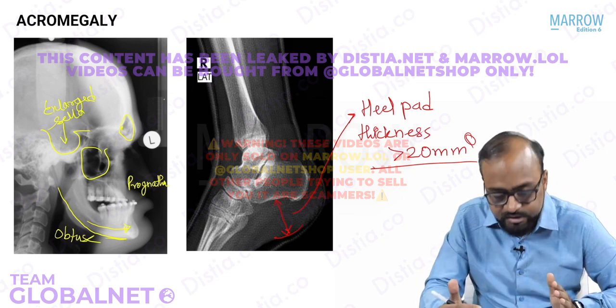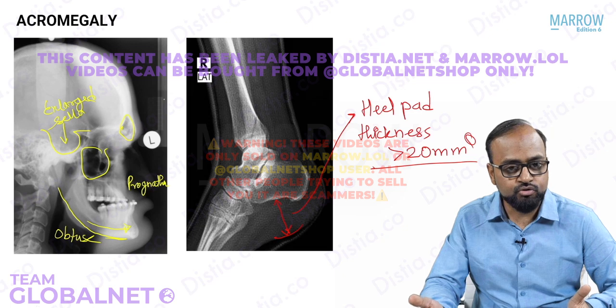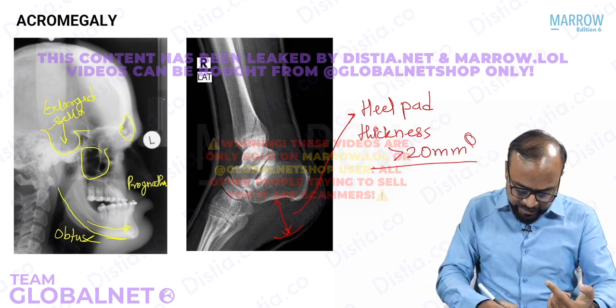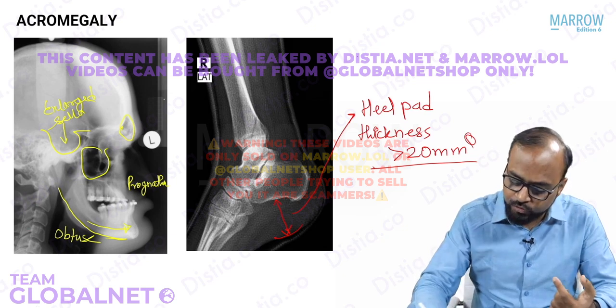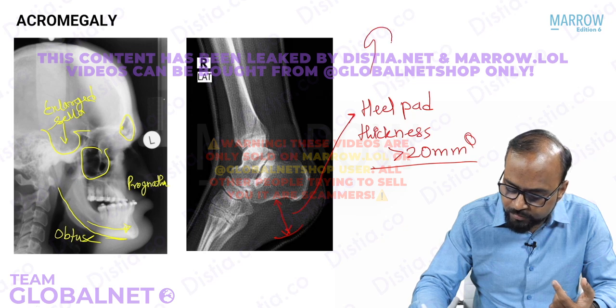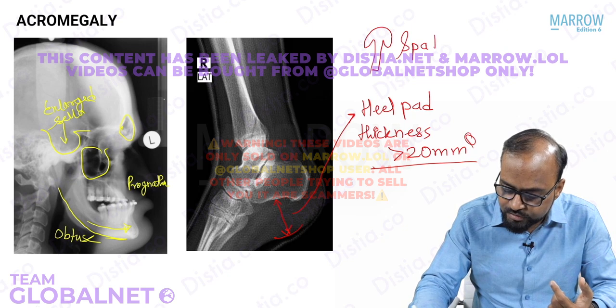Now heel pad thickness, increased soft tissue thickness is also there. Now the phalanx takes a very peculiar shape, though I could not find a specific image for you. The terminal phalanx takes a very peculiar shape like this. This is called a spade-shaped phalanx.